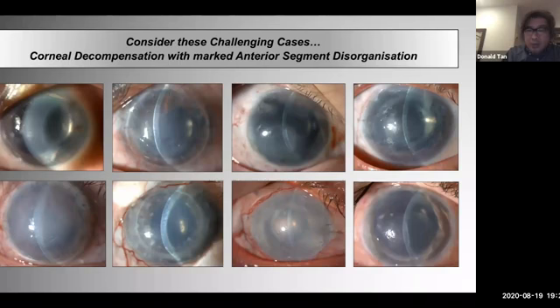The iris a lot of the time is distorted, it's widely dilated, it's no longer functional actually. But more importantly, it's also stuck to the angles, peripheral anterior synechia that shallows the chamber. And often these eyes also have an open vitreous compartment. The IOLs may also be a bit unstable as well. So how do we handle these cases? This is the challenge facing us if you're going to try and do a DMEK. And most people quite often would try and do a DSEK, or worst come to worst, just do a PK.